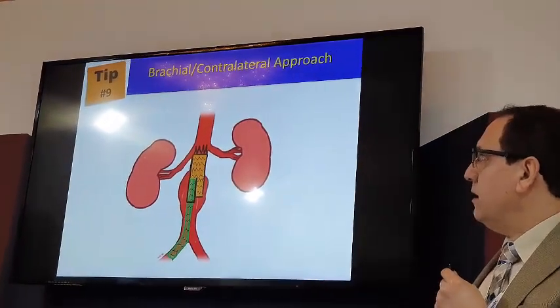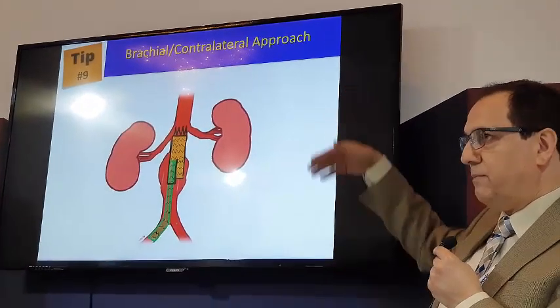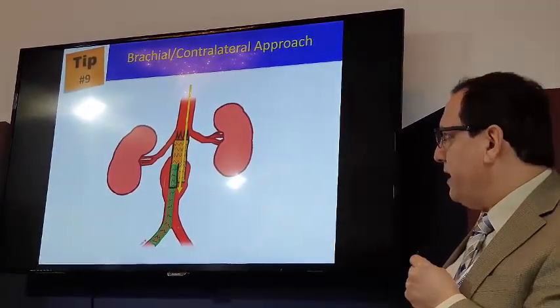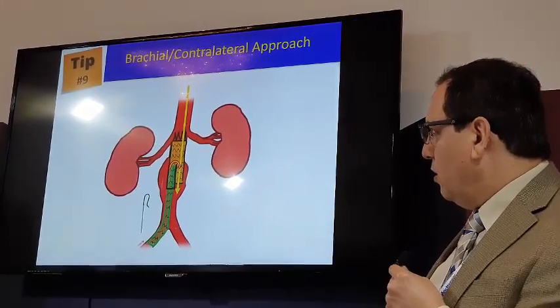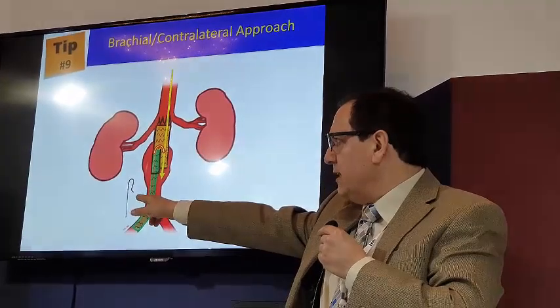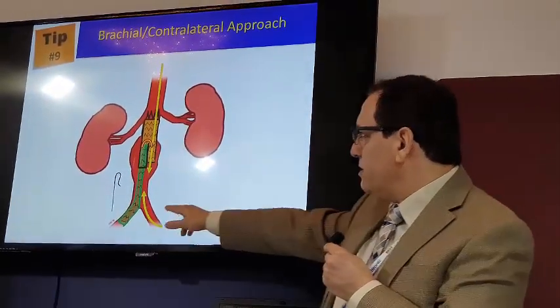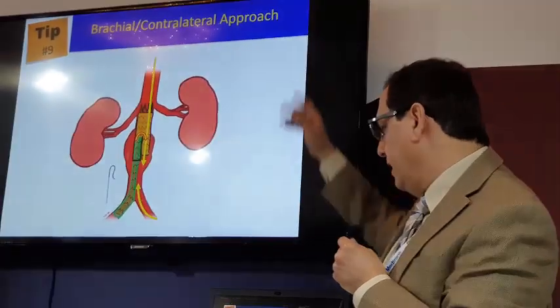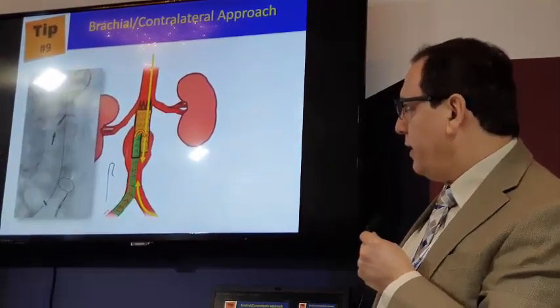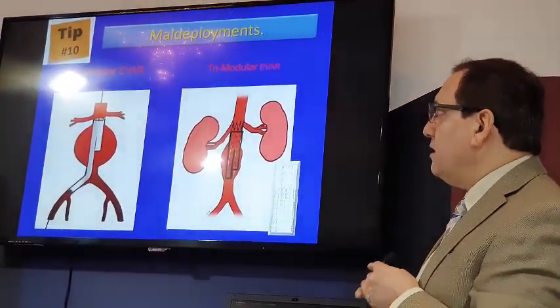Tip number 9. If you cannot get cannulation with all these tricks, the easy way is just go from the brachial. It's very simple. You go from brachial, or you can go from the contralateral limb by using the contralateral catheters and get the wire inside. Then go from here, snare the wire, flip it over, and you can cannulate. You get the wire, you snare it, and then you are inside and you can finish it. This is the last one.